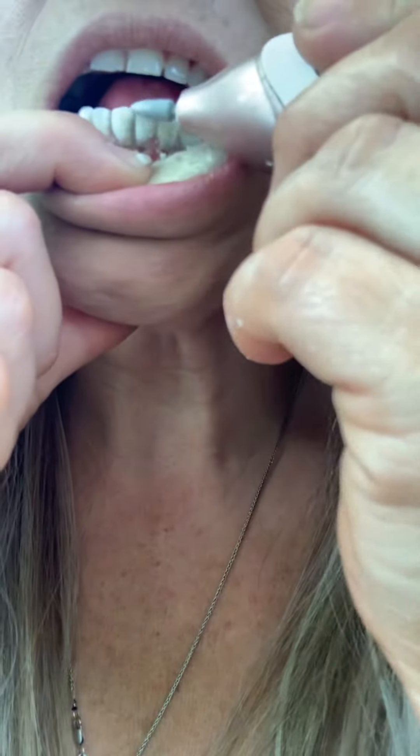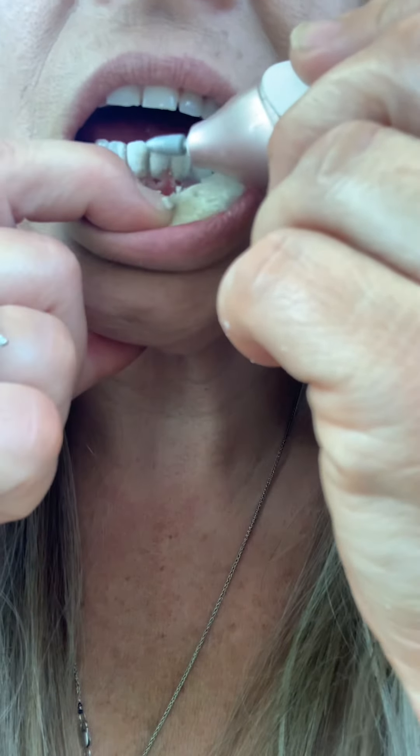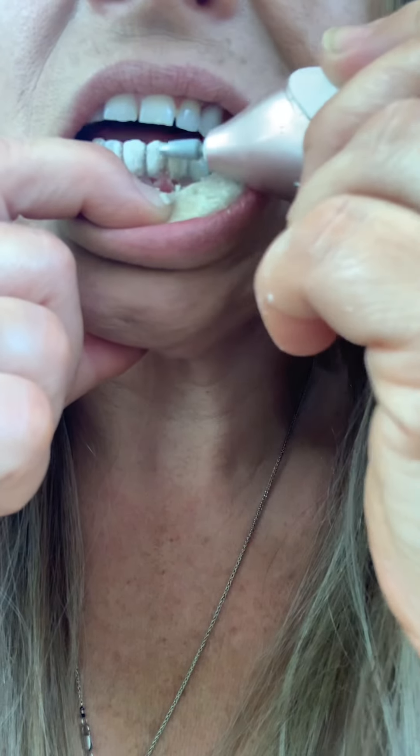We have this, which I'll use in a couple minutes here. Give it another second to dry. It doesn't hurt. Don't get it wet — it's probably best to let it dry a little longer.